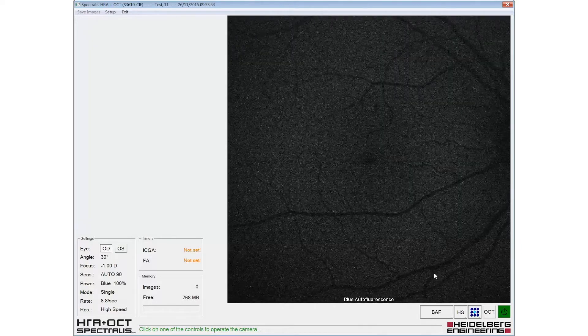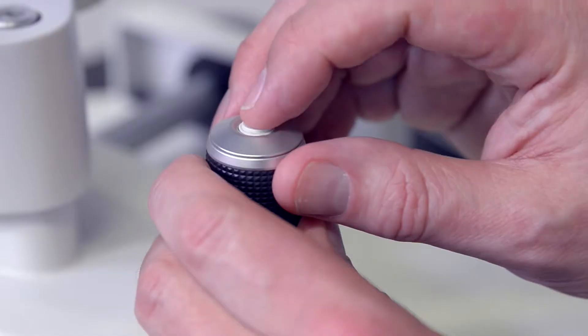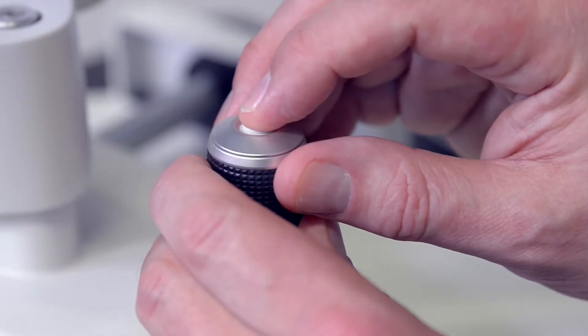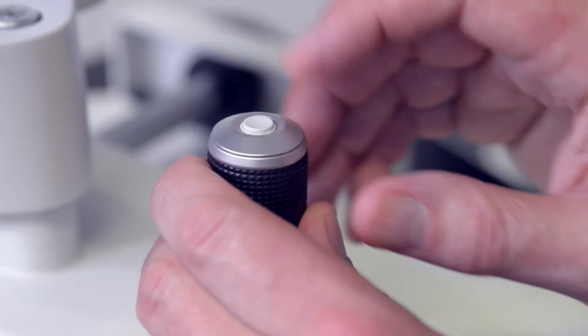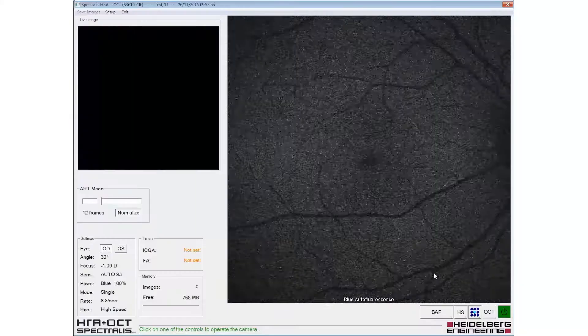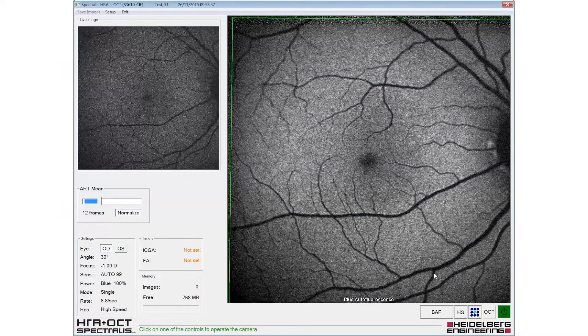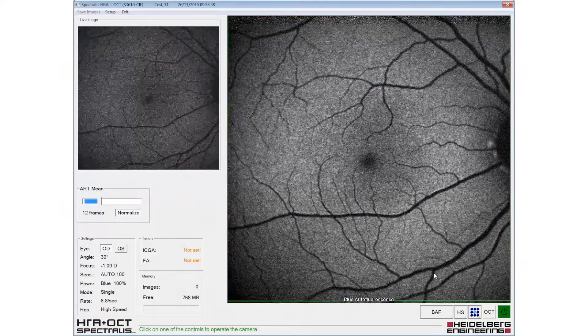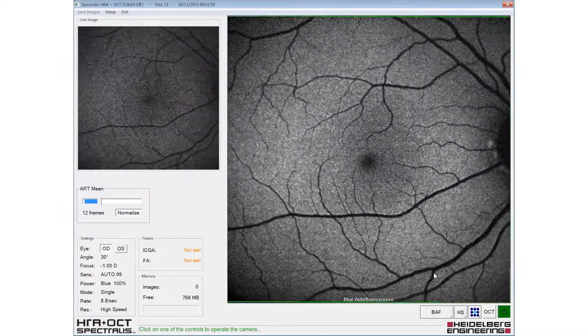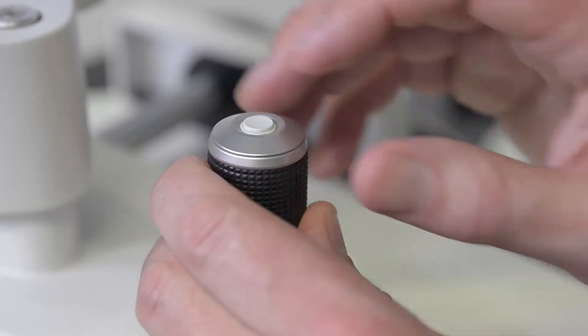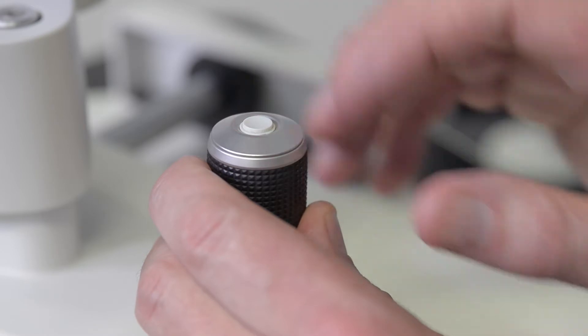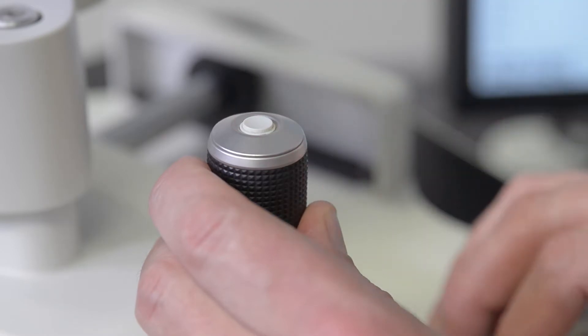Eye tracking and automatic real-time averaging engage with a long press of the joystick button. Once the ART value reaches the desired number of frames, images can be acquired with a short press of the button.